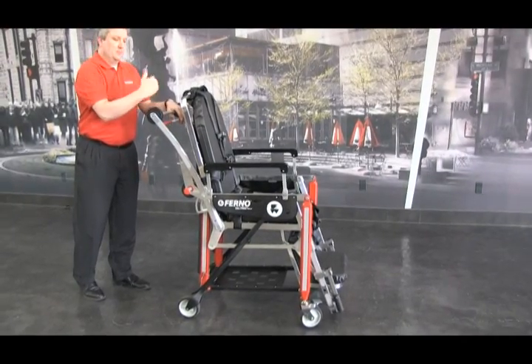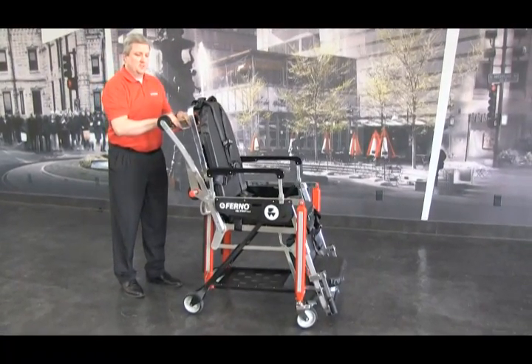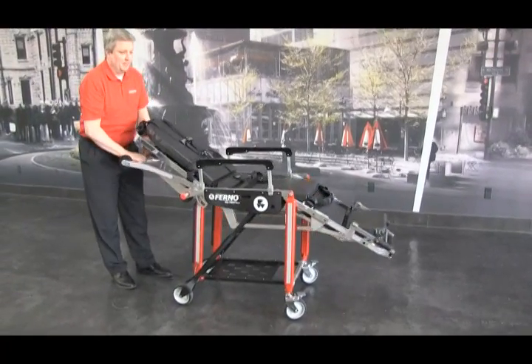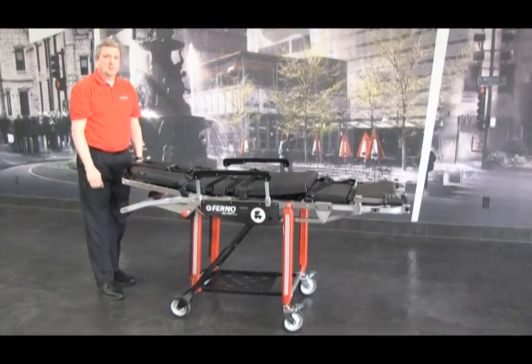To put it back into the stretcher position, it's just the opposite. Push forward slightly towards the patient, pull the handle, and bring it back. Release the handle and it stays in the stretcher position.